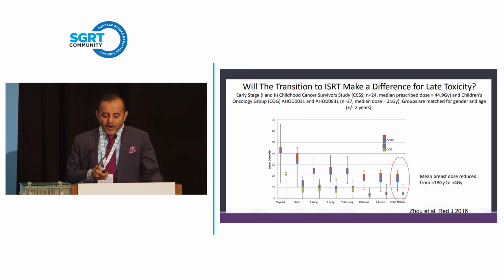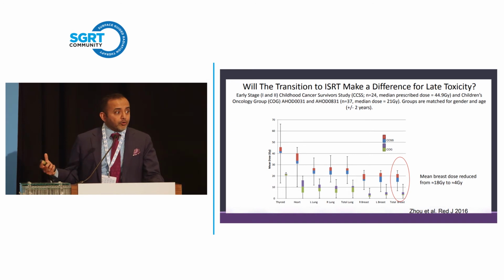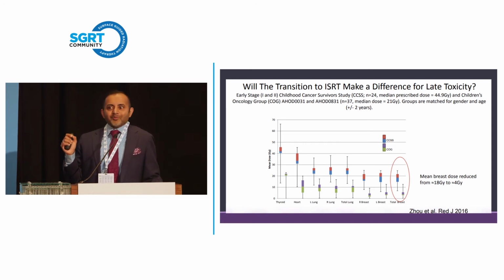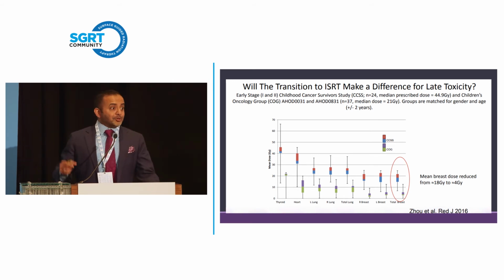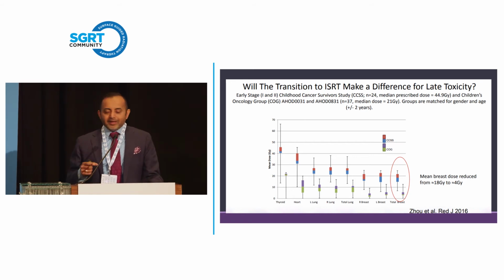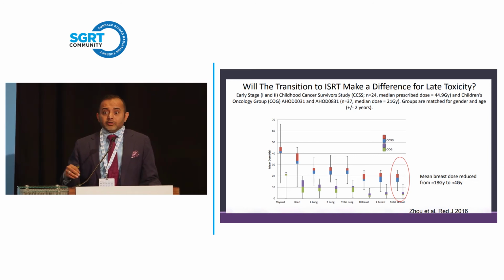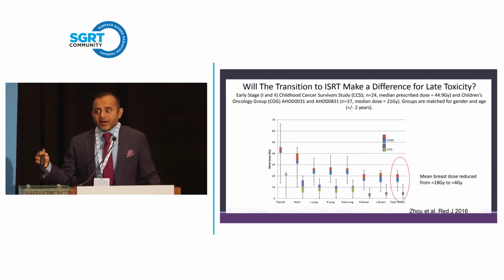So one of the things that I worry about a lot is how do we spare the heart today? Just like in breast cancer where we use deep inspiration breath hold, and as you all know, 15, 20 years ago, we used to do fluoro to set up our breast patients. We wanted 2 centimeters of lung to set those tangents, right? I don't know how many of the therapists here are old enough to remember that. Do you guys remember that, right? We used to want 2 centimeters of lung on fluoro. So we treated a crap load of lung, pardon my French, and the heart on a left-sided breast cancer was always in the field. So the LAD, especially the inferior aspect of the LAD, literally saw 50 gray of radiation that you gave to the whole breast.